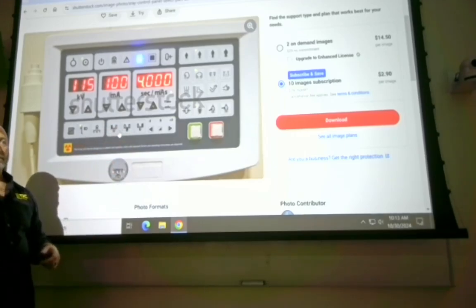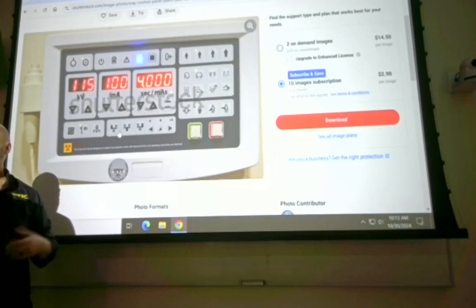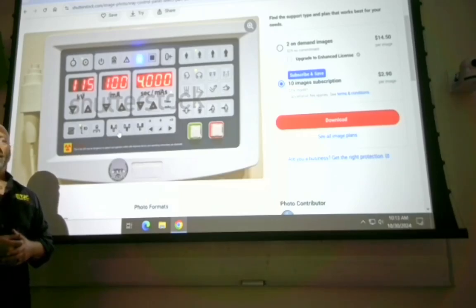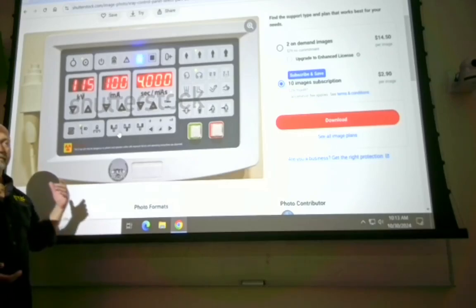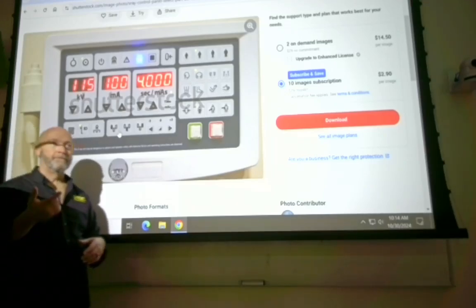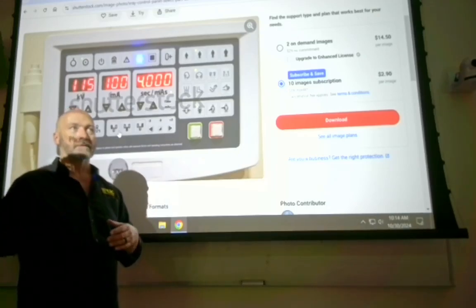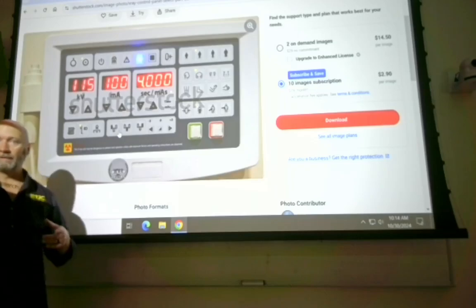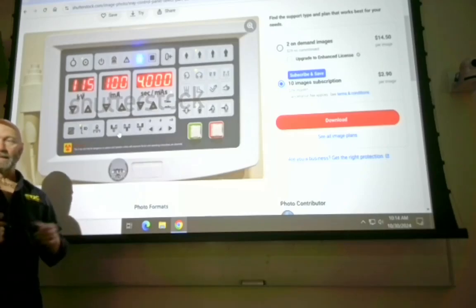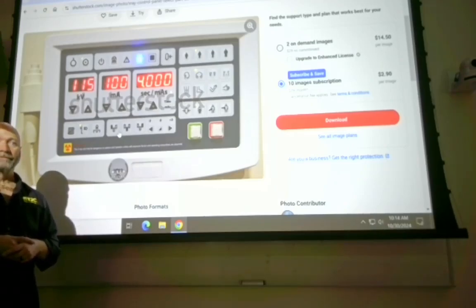And I've worked in hospitals where they say, well, you've got a whole lot more flexibility if you don't use the photocells. You have more flexibility in your position, which is true. But what do you have to know if you're not going to use photocells? Technique. Right. So why do you suppose it is that we have on your first, second, third level checkoffs different expectations for setting technique? Your first one, what do you have to do?